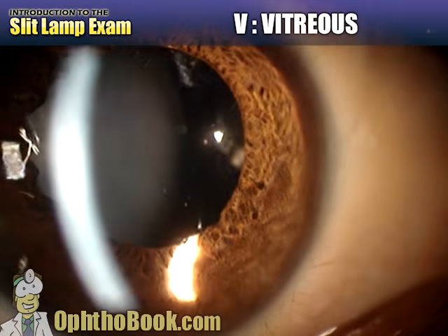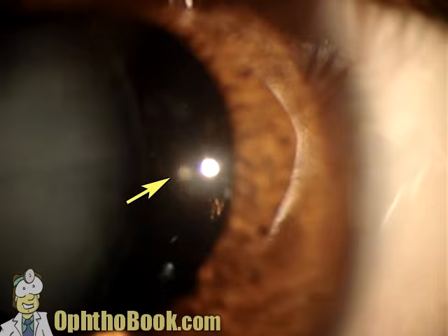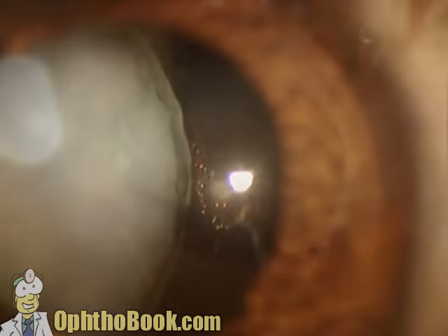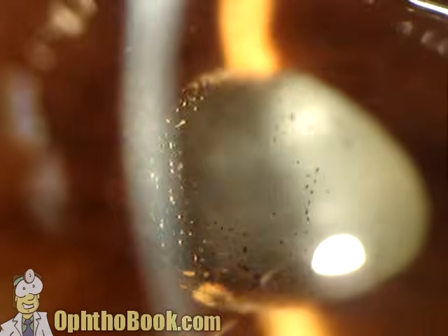This is the vitreous coming around a dislocated lens after trauma, and it has pigment stuck in it. It makes it a lot easier to see that jello back there as it kind of peeks forward in the front of the eye. Here's another case of vitreous, a big bubble of it right there in the anterior chamber with pigment stuck on it, little spots, makes it a lot easier to see this clear material.